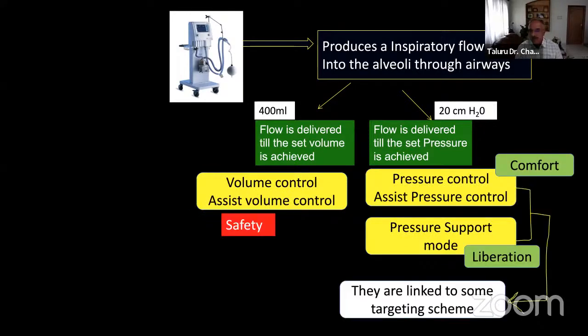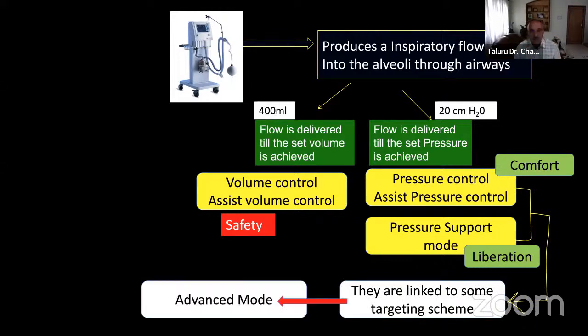See, these are only these 2 modes. If they're linked to a target system, all your advanced modes come. So don't confuse. Advanced modes are nothing but a pressure control or a pressure support linked to some target scheme, and then advanced modes are produced.